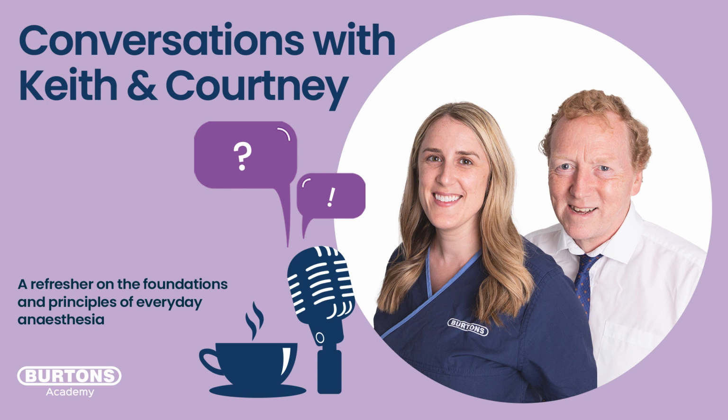So I hope that's helped you think about the effect of compliance. I do want to stress that we, as the person controlling that patient, have an enormous effect on that compliance. Do be careful about putting them on their sides and putting sandbags on their chest to hold them still in X-ray. Do be careful about crossing their legs over at the front, restricting chest expansion. Do be careful about wedges down the side of cradles. It has a big effect, and we're affecting the compliance, and then the way that we're ventilating those patients.